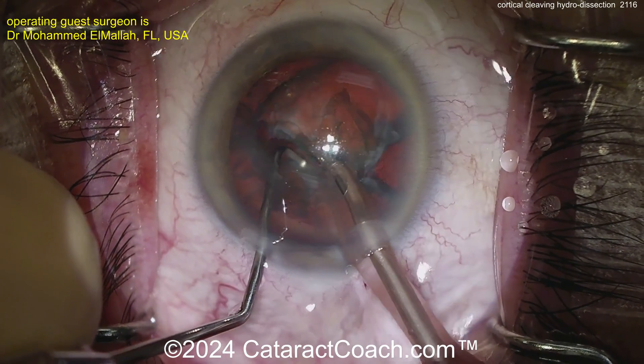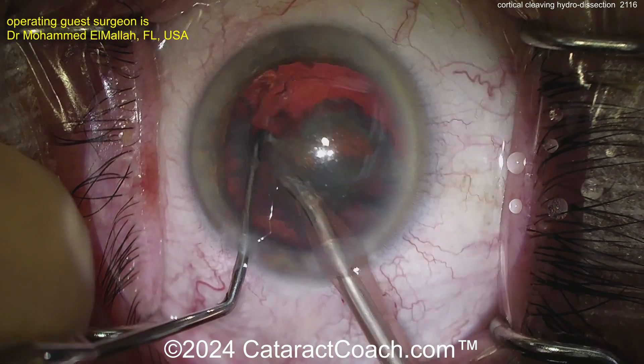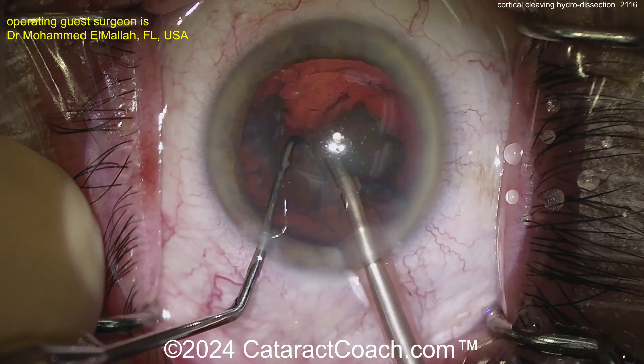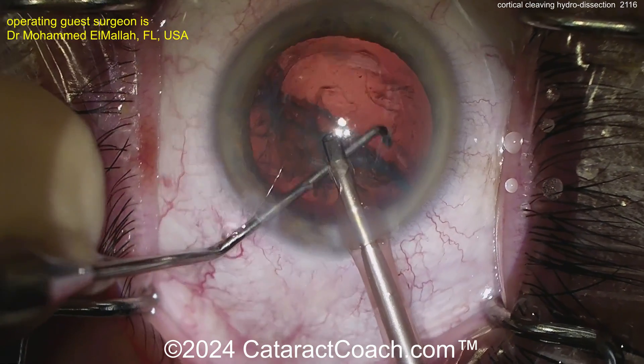Taking out the rest of the nucleus — it comes up pretty easy. Now look in the capsular bag. You see no cortex. It was a pretty easy hydrodissection here, and it cleaved all the cortex off the bag, or the vast majority of it.